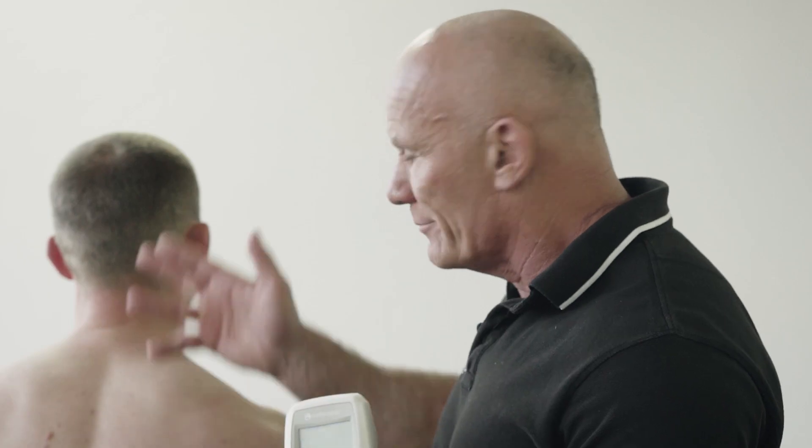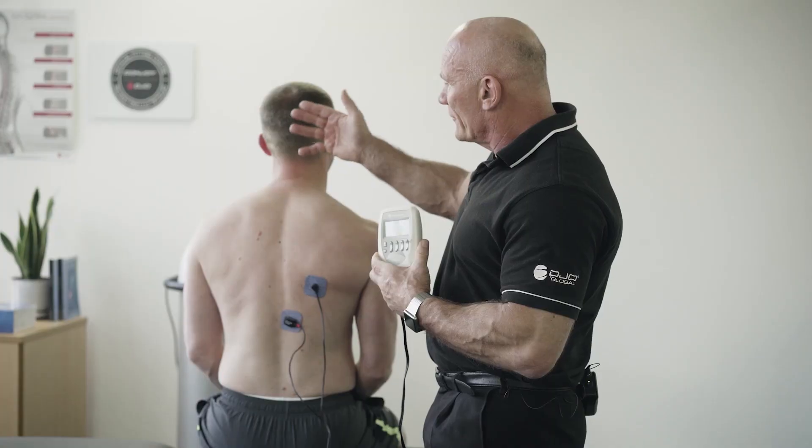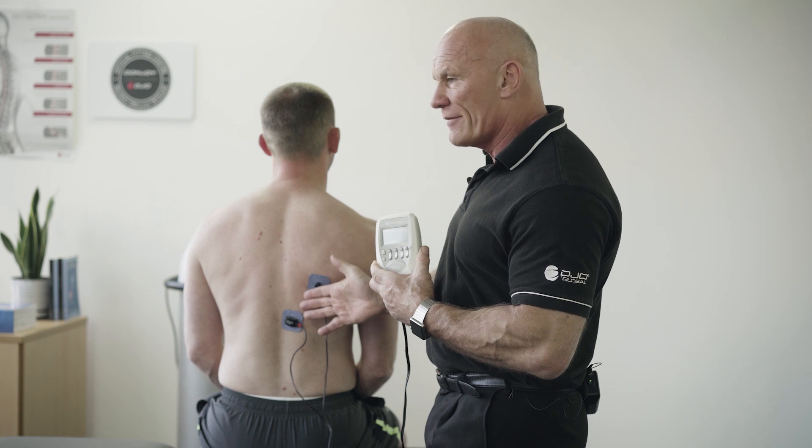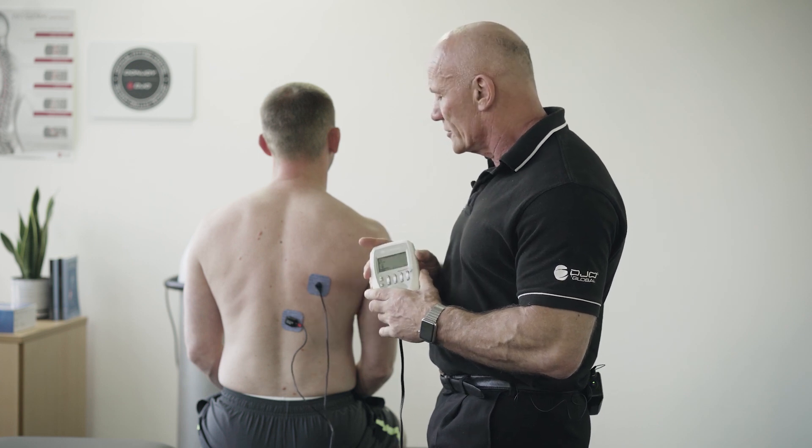We also get an afferent impulse to the brain, and in turn the brain processes that information and provides an efferent stimulus back to the muscle.